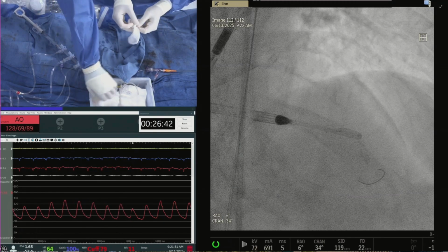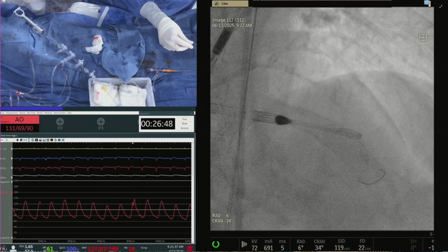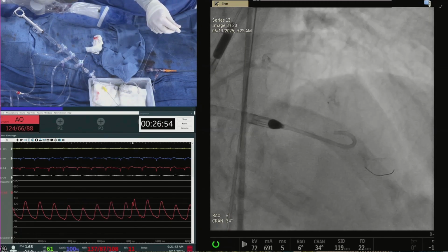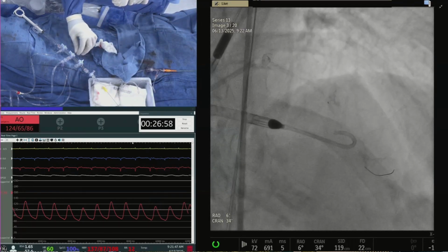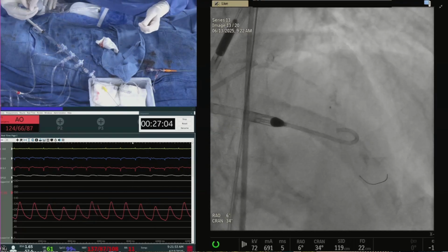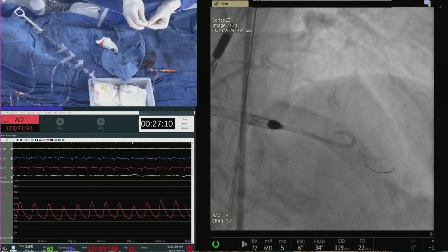The question will be what size burr, because now everything is based on imaging, but based on our experience, what I call EYE bus, where you use your eyes to understand. Likely we will use a 1.25 burr, not a 1.5 burr, just because of the way the diagonal is taking off. You have to make that turn. So we will go with a 1.25 burr.